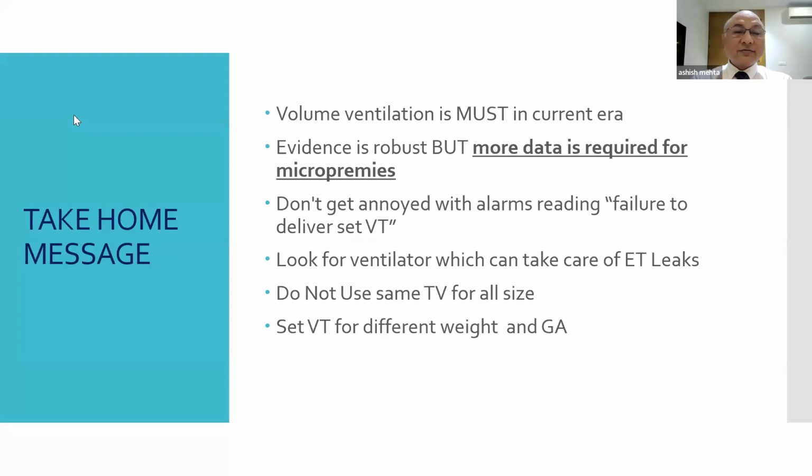Yeah. As we have said, although most ventilators calculate the expiratory tidal volume, even during expiration some amount of leak will be there. So whatever expiratory tidal volume we are getting is not actually the volume that has been delivered to the alveoli. So in the VN series, they give three tidal volumes: VTE, VTI, and VT. VT means the tidal volume actually delivered to the alveoli. And they have automatic adjustment in the flow. Their bias flow goes up to even 29 liters per minute.